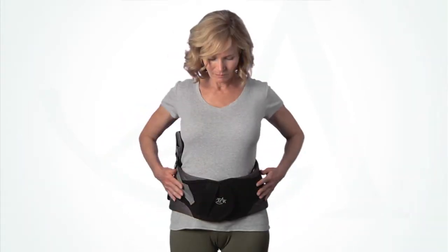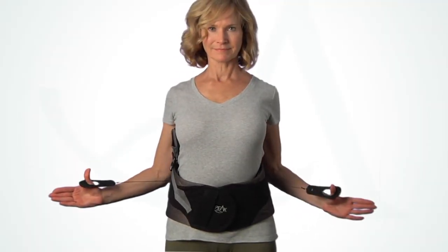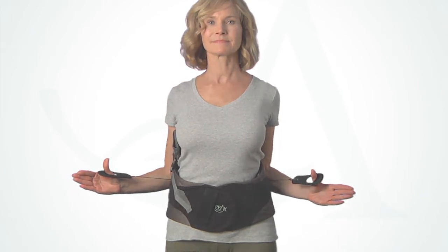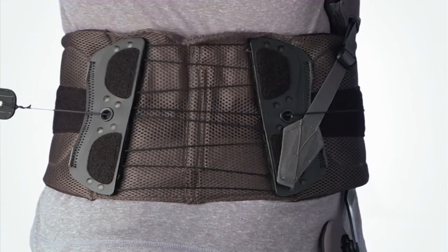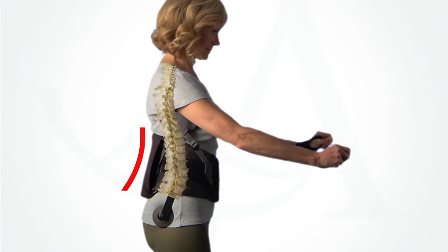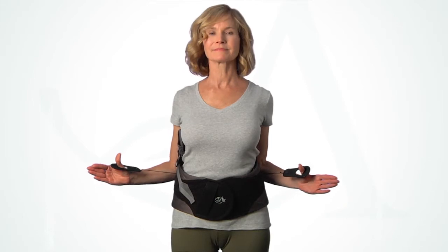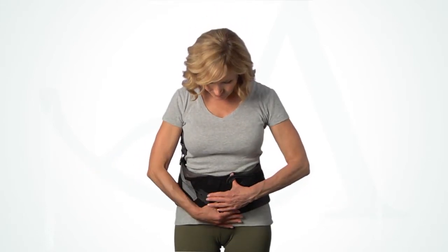Have the patient tighten the brace by pulling the pull tabs away from the body. Over-tighten the brace, then loosen slightly to achieve a supportive but comfortable fit. Be aware that the right pull tab controls the upper compression and the left pull tab controls the lower. As the compression is tightened, the self-adjusting back panel contours automatically to the lumbar spine. Once the appropriate compression is obtained, place the pull tabs on the anterior panel and press down to secure.